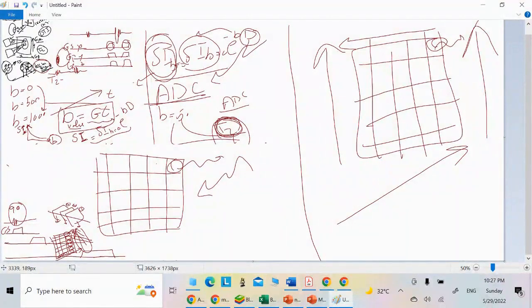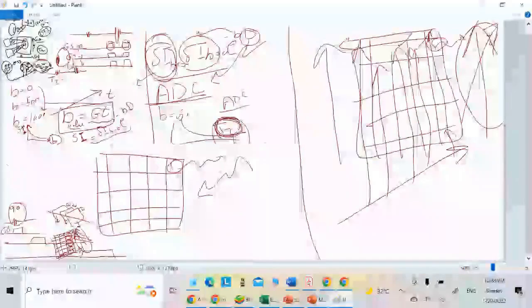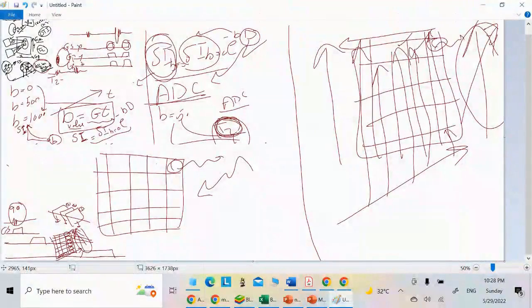Now, the frequency or location and the phase depend on the y-axis gradient and the x-axis gradient, because you will know how fast these points are rotating. So, in the y-axis, it rotates and comes to you at an earlier time. And since it comes to you at an earlier time, you now know exactly the result of the gradient you applied at the location of the voxel.